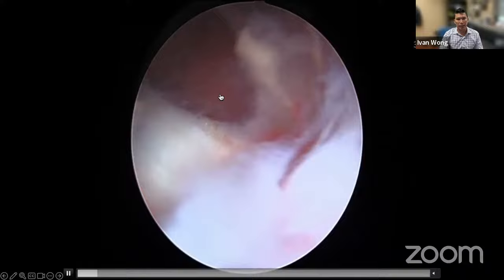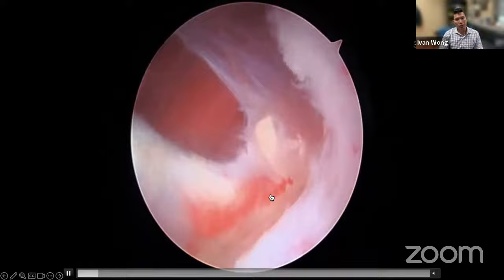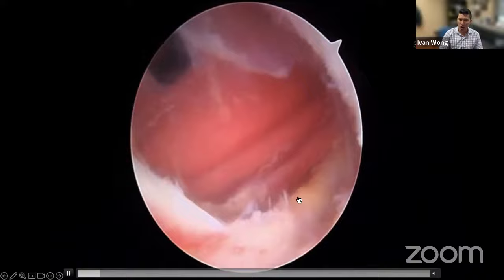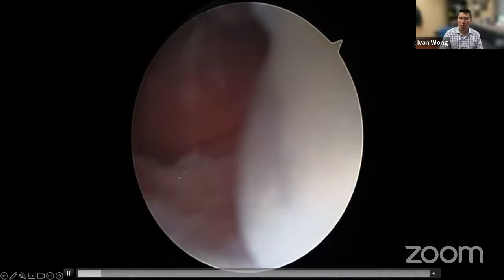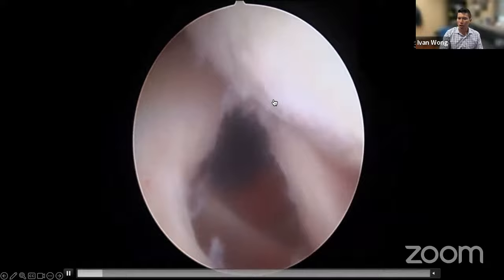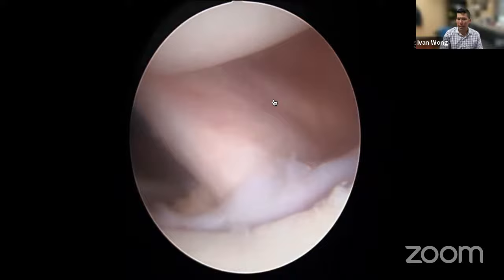Once we see the CA ligament, we continue opening the rotator interval to identify the conjoint tendon. With the head reduced, you can see the conjoint tendon coming up on the lower right side. The key is pulling the head posteriorly to open up the space between the subscap — which is the first tissue right here — and anterior to subscap, which is the conjoint. Pulling the head posteriorly retracts the subscap and reveals the conjoint tendon. That completes the rotator interval opening.